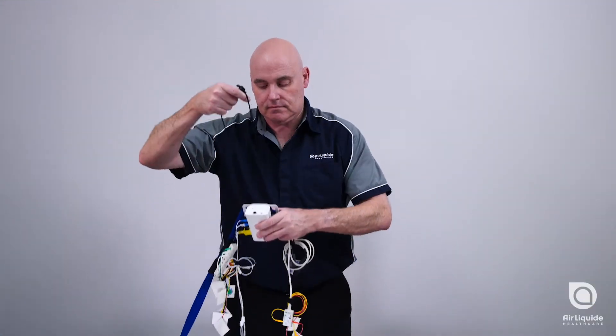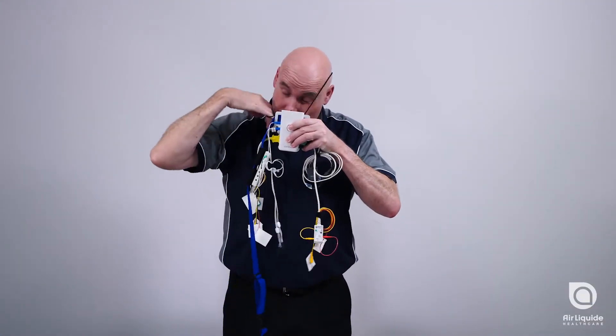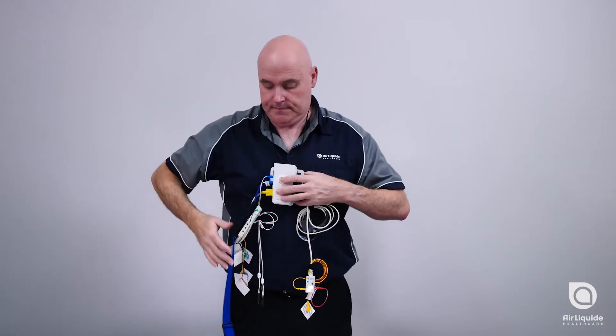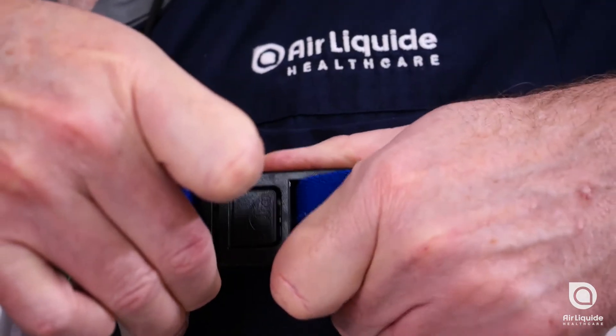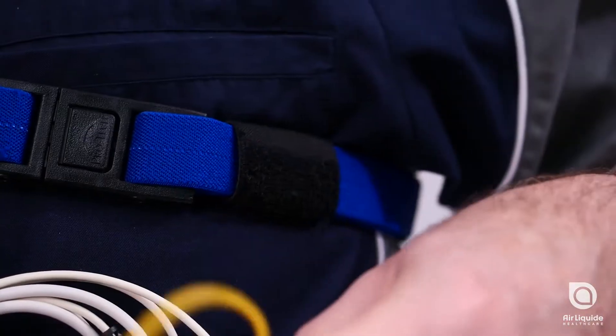Start with the chest belt and device. Place the lanyard attached to the device over your head, then wrap the belt connected to the device around your chest, just under your underarms, and clip the two ends together.